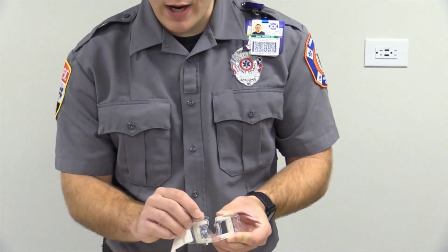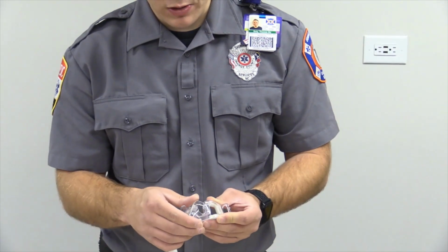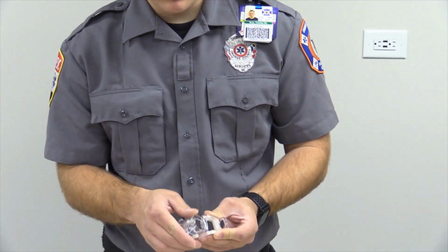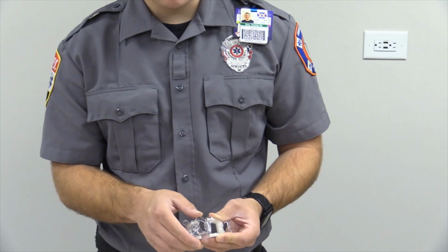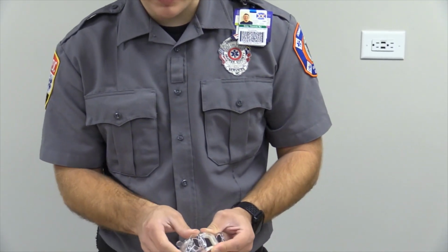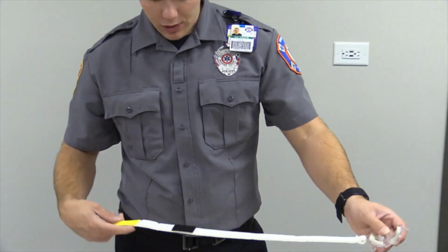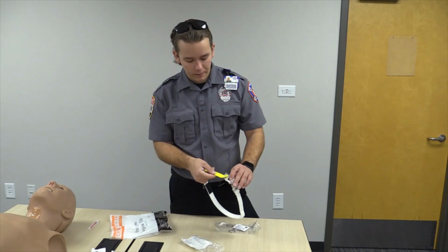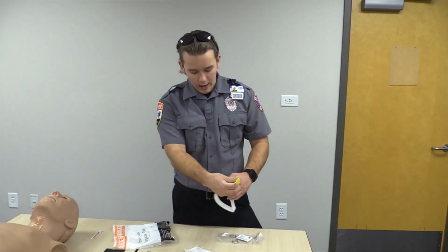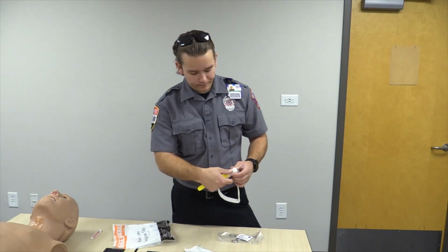As you see here, there are actual teeth on here. After you place the tube and you push these teeth in, this will actually lock in place. Okay? So make sure you remember that once you insert these in, as you see here, this is locked and this is not coming out. You're going to put this on just like you would your regular ET tube holder, and that white Velcro on this side is going to secure just as this.